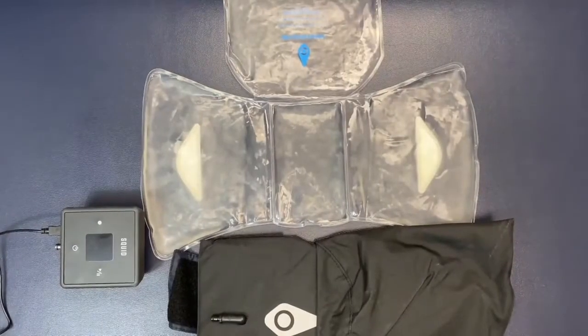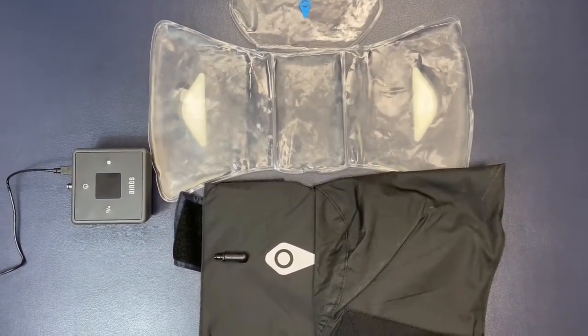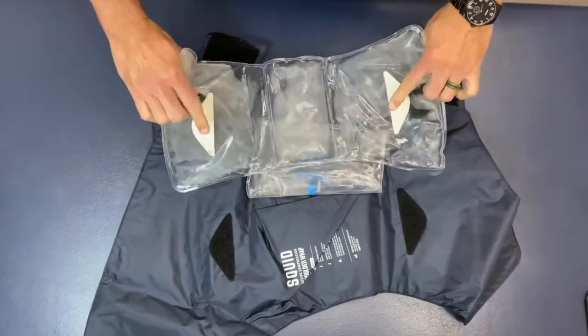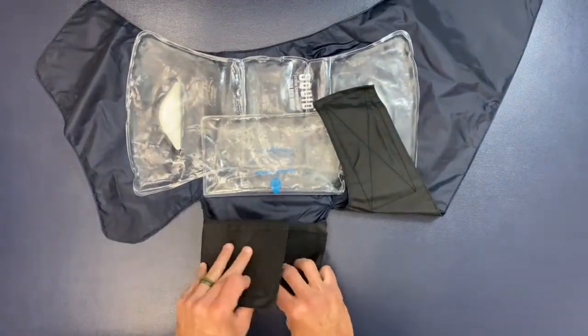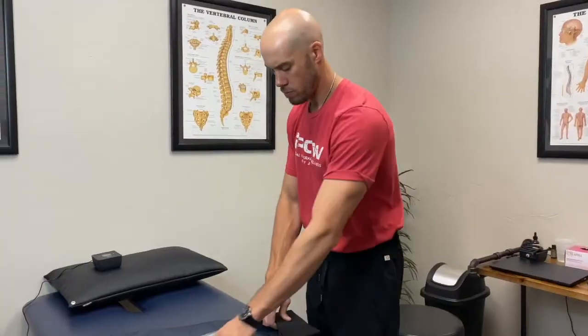Once the control unit is fully charged and the gel pack is frozen, you're ready to get started. Setup is quick and easy. Attach the gel pack inside the wrap using the Velcro tabs. Before putting on the wrap, fasten the straps on either side of the tube connector together to create an arm hole. Insert your arm through the arm hole with the connector pointing towards your wrist.